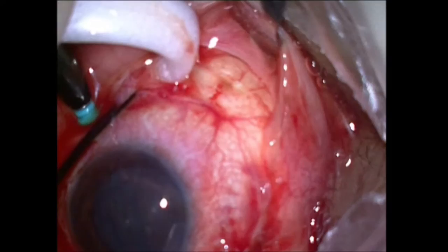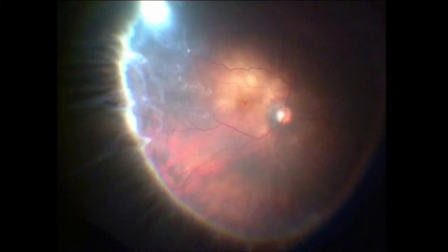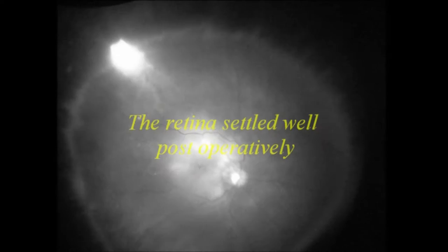External drainage is carried out. Adequate buckle effect is seen with all the tears well indented. The retina was well settled postoperatively.